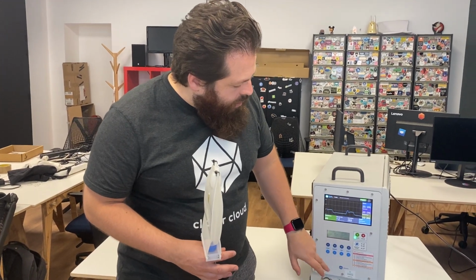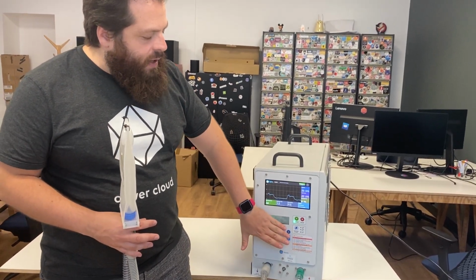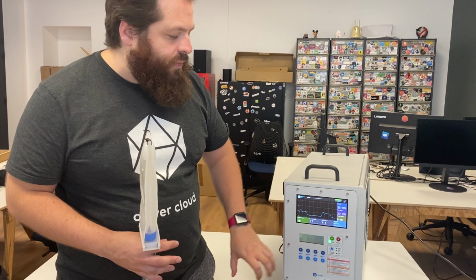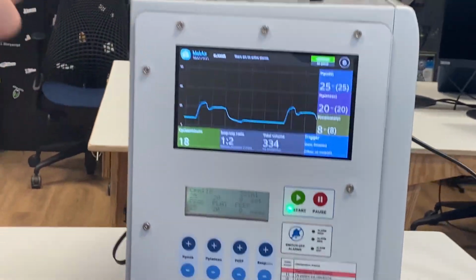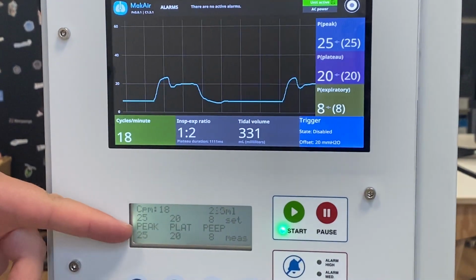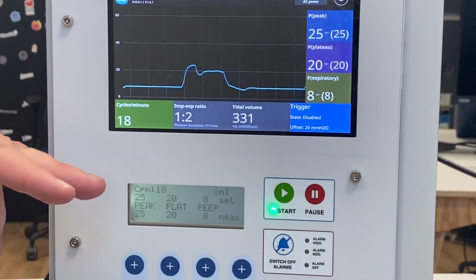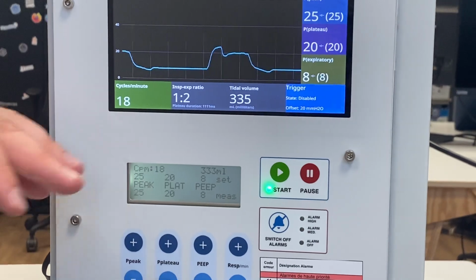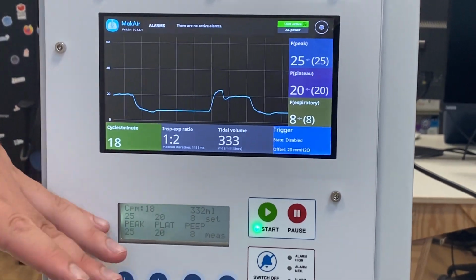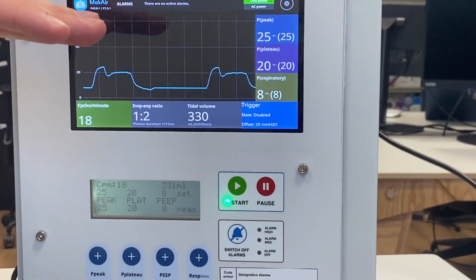If I keep the system down a little bit, everything is going very well. You have real buttons here to make the regulation, and there is all the data about the system working with the curve. This one is really sure because it's linked inside the really regulatory curve of the system, so it's inside what we call the servo loop on the system, and it will never have a failure which can happen in another way. So that means it's very efficient for hard case situations. The whole system is made for the security of the patient.